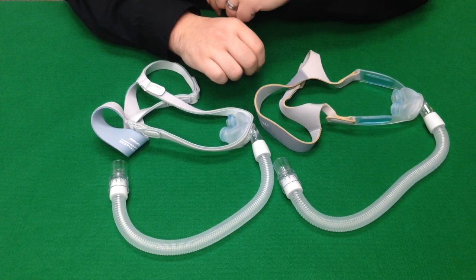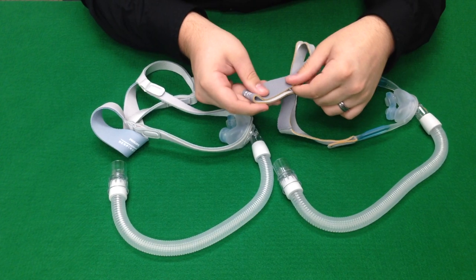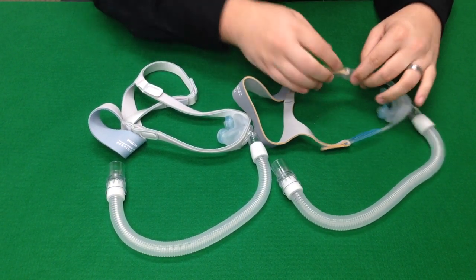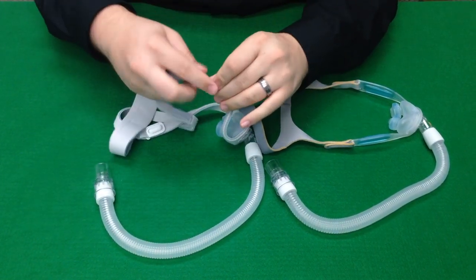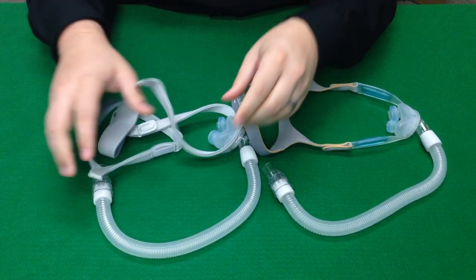Differences are also found in the headgear between the two versions. The Nuance Pro has a gray back strap and has tabs to loop into the frame. The Nuance has a blue back strap and has metal slots for the frame to be inserted into.